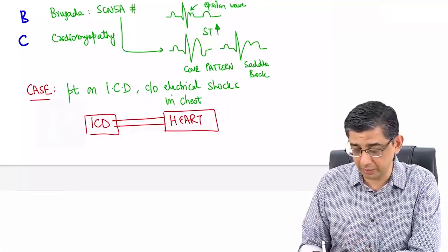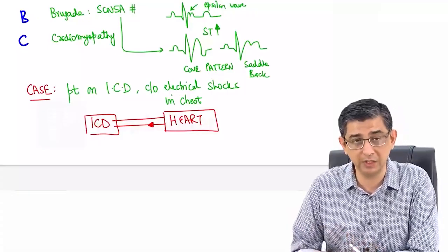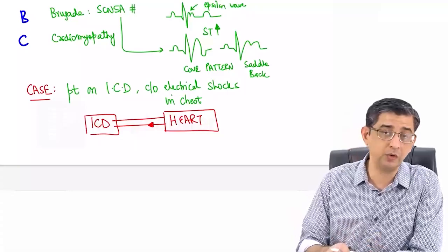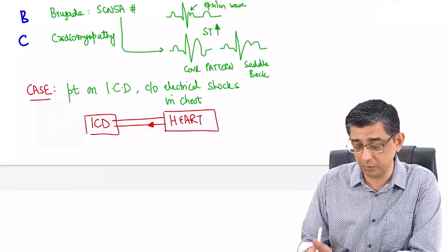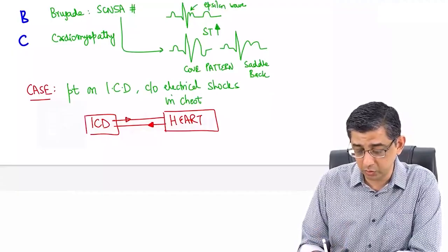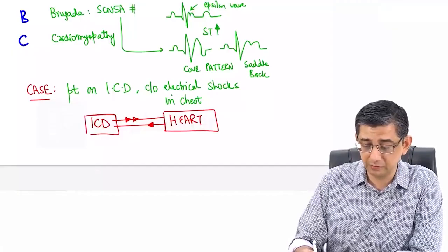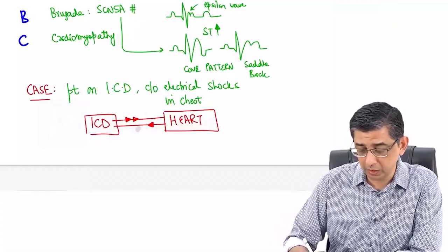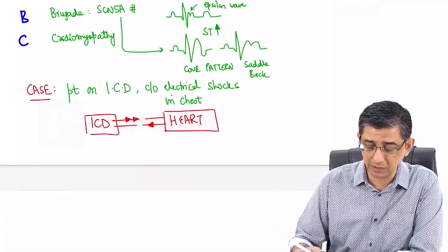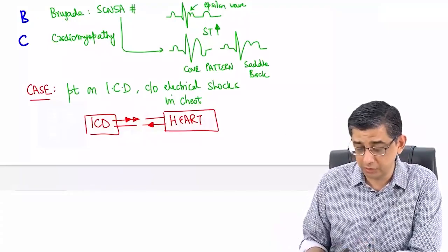I mean, if the heart is beating properly, the electrical activity of the heart will be transmitted to this computer, that is ICD, and the computer is programmed that if this information is not present or the information is abnormal, then the computer knows only one thing to do: deliver a DC shock and get rid of the arrhythmia. Now what I'm saying is, hypothetically, just imagine the leads get fractured, due to either poor quality, or maybe just accidentally it happened with this person. He is an unlucky fellow, there was a lead fracture.